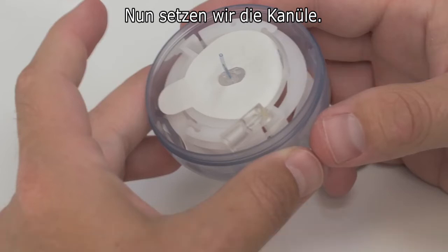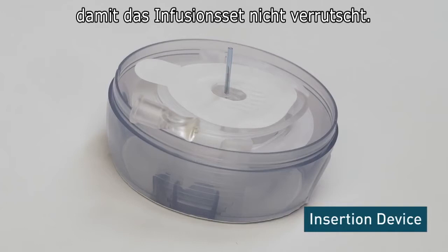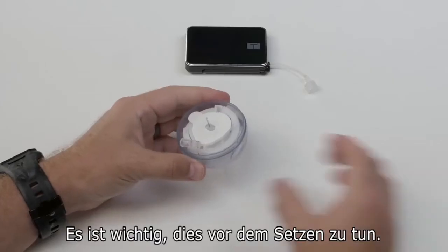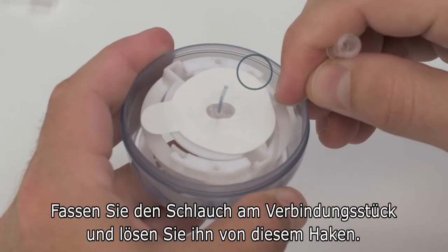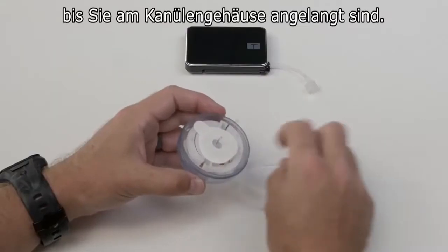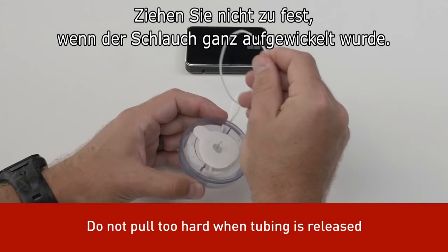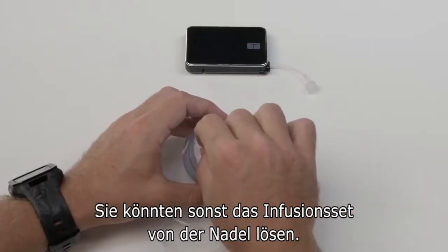Now we're going to get ready to insert the cannula. It's important to be gentle when handling the insertion device to keep from moving or dislodging the infusion set. First, we'll unwind the tubing — it's important to do this before attempting to insert the site. Carefully grab the end of the tubing by the connector and dislodge it from the tab. Then gently pull it upwards to unwind, stopping when you get to the end so you don't move the cannula housing. Be careful not to pull too hard when the tubing is fully released.